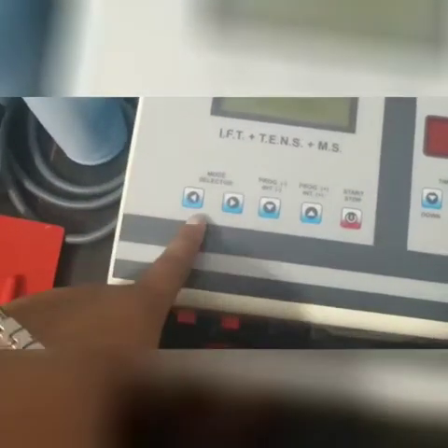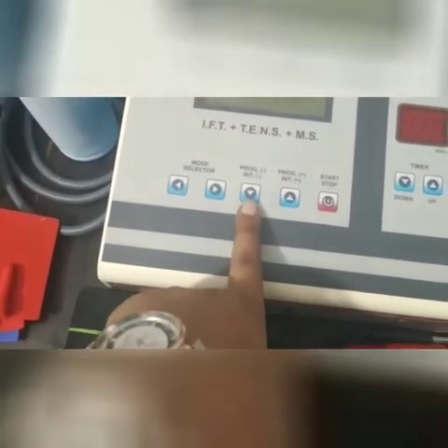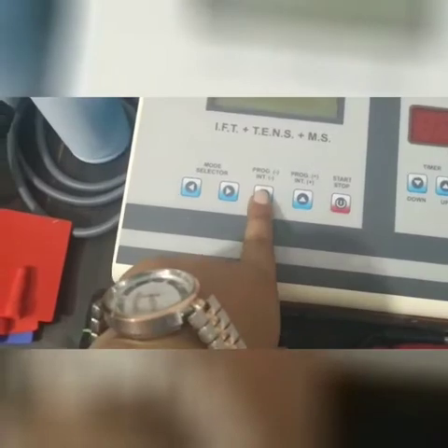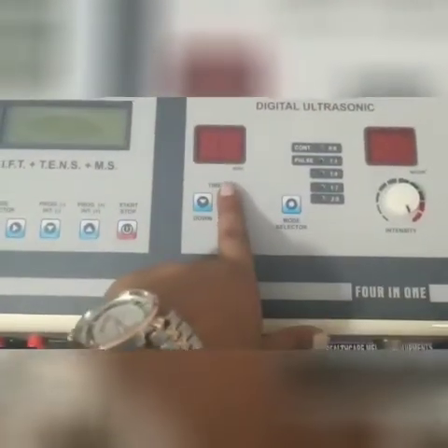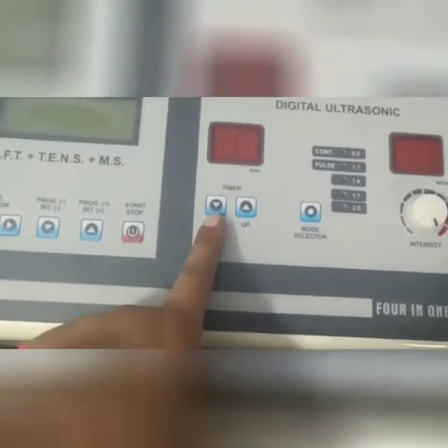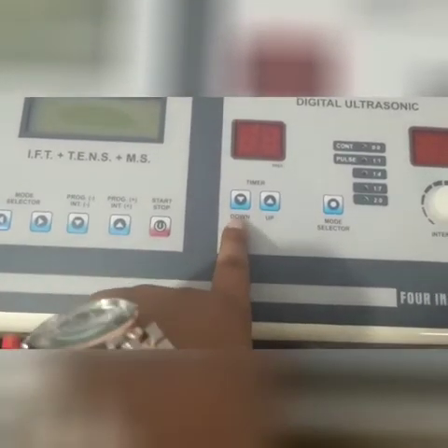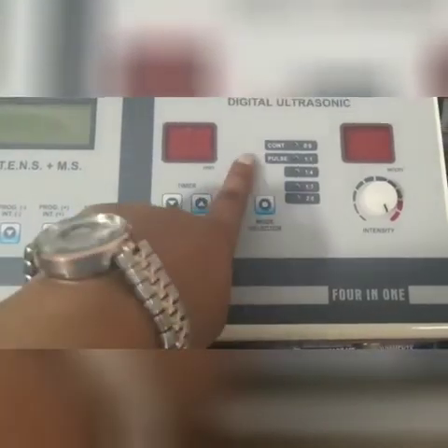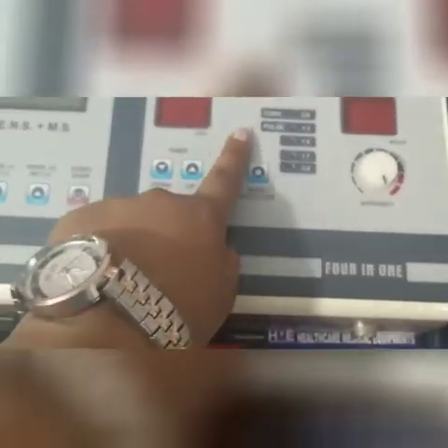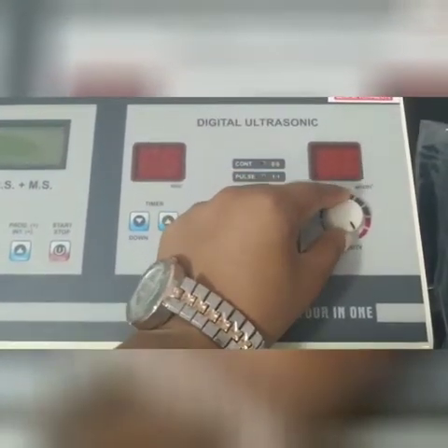This is the mode selector button, this is the program selector button — you can decrease the program from here and increase it from here. This is the start/stop button. On the ultrasonic side there is a timer — you can increase the timer with this button and decrease it with this one. You can select the mode; there are 2 modes: continuous or pulse. There are 5 LED indicators for ultrasonic and this is the intensity button.